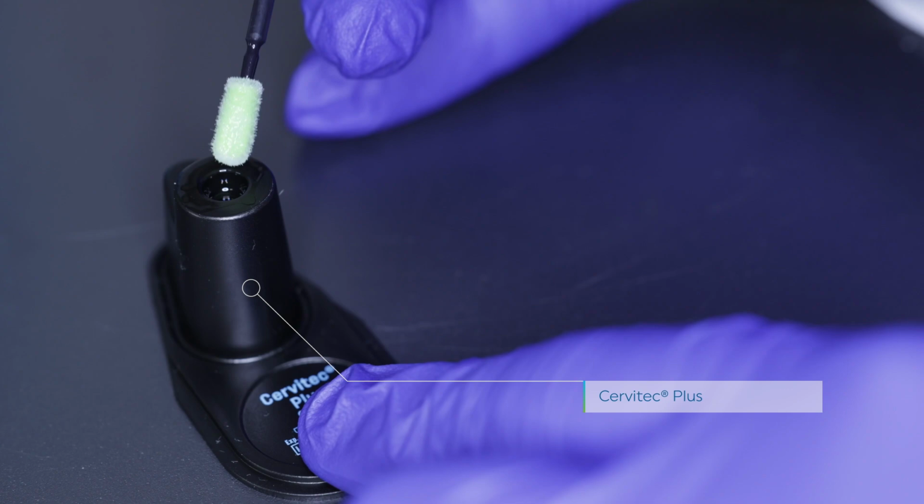And patients will come back and tell me that their teeth are sensitive. But the main reason that I'm doing it out of the gate is because Cervitec Plus actually is an antimicrobial. It also helps desensitize, and it's going to clean off any areas around every attachment and really seal those areas. Remember, we acid etched, we did bonding. I love Cervitec Plus because it also is not like your typical fluoride. It's not goopy, it's not sticky, because the last thing that we want is for the patient not to have a reason to put back on the first aligner. This is more like water, but what it does is it's going to clean off all the areas of where the attachment's going to be placed, and most importantly, help desensitize.